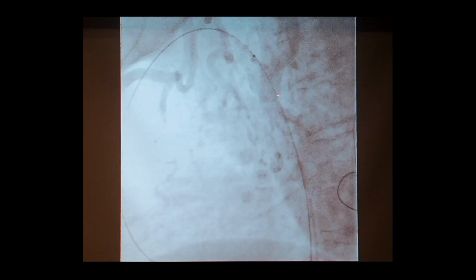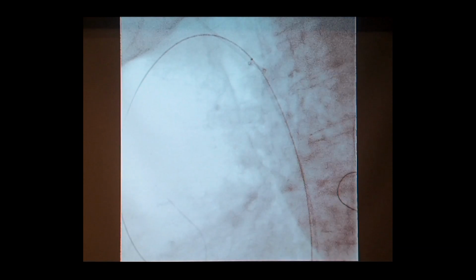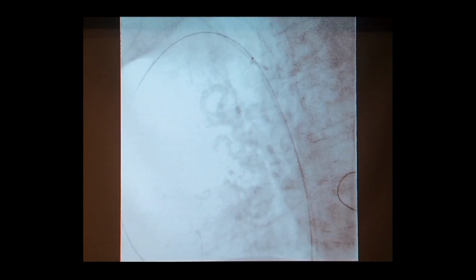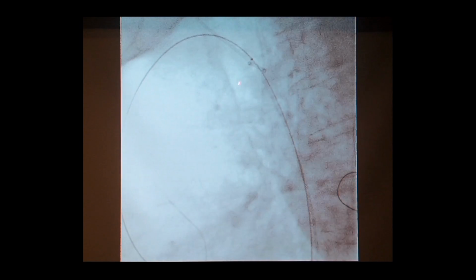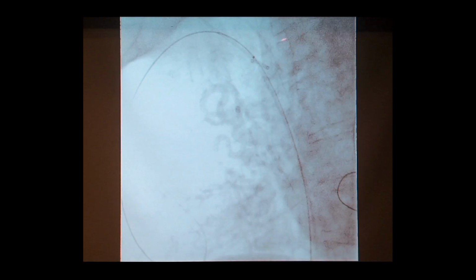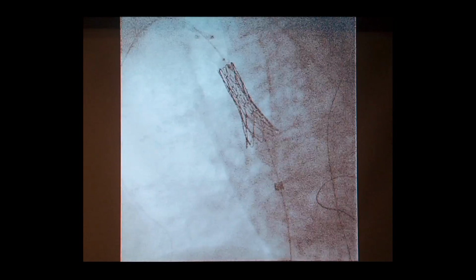And see how abruptly the aorta is cut off? Can you see that? And what the body is trying to do is develop its own collaterals, and those are all big vessels, which normally in real life should be tiny branches, but it's opened up all of these to try and supply the lower half of the body because nothing can hardly get through. This is almost what we call the near total occlusion of the aorta. You can see a tiny little passage through which we managed to get a wire up there. And essentially this is what we do.